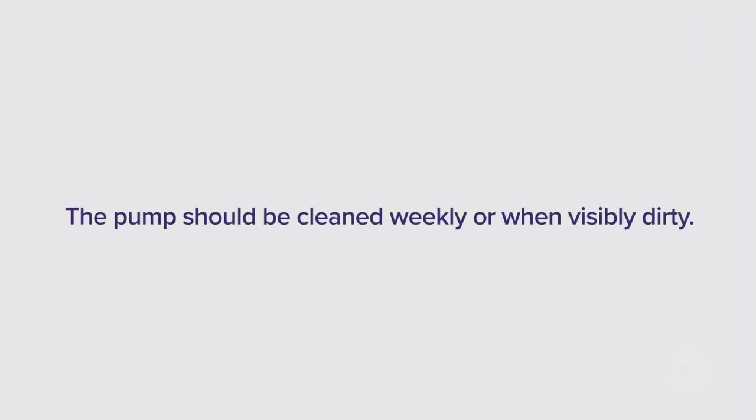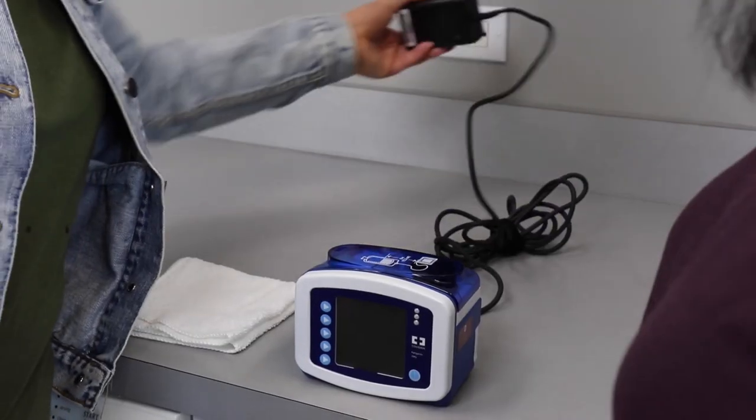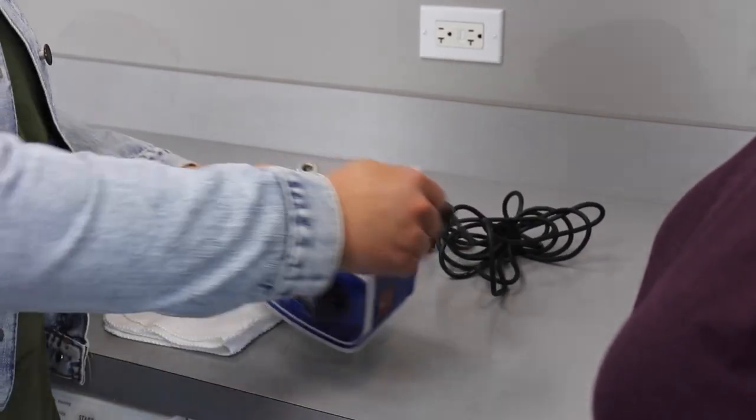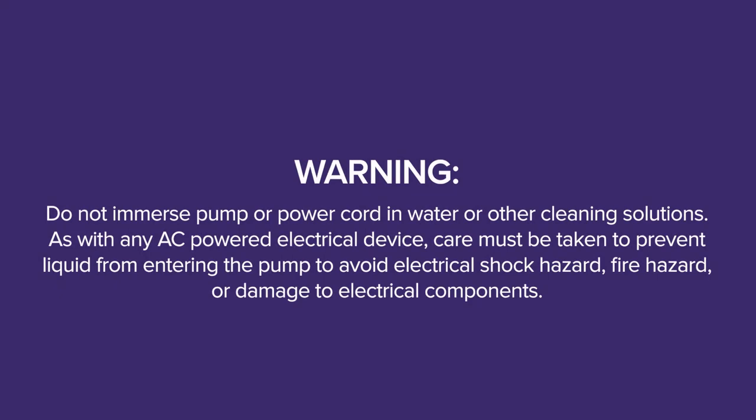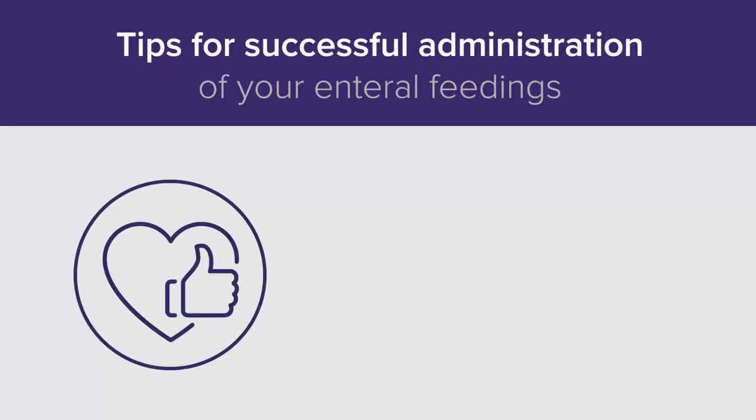The pump should be cleaned weekly or when visibly dirty. To clean, first ensure the feeding set is not loaded. Unplug the power cord from the enteral pump. Using a clean damp, not wet, cloth, gently clean the surface area of the pump, including thoroughly cleaning the area where tubing is set and the black rotor wheel. Warning: do not immerse the pump or power cord in water or other cleaning solutions. As with any AC-powered electrical device, care must be taken to prevent liquid from entering the pump to avoid electrical shock hazard, fire hazard, or damage to electrical components.